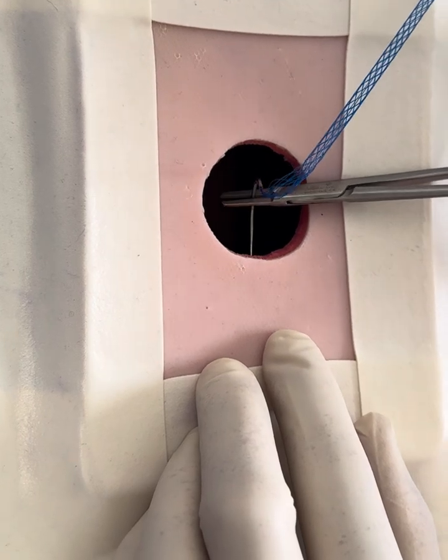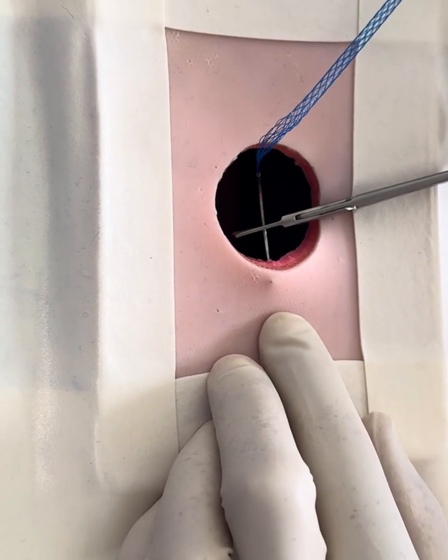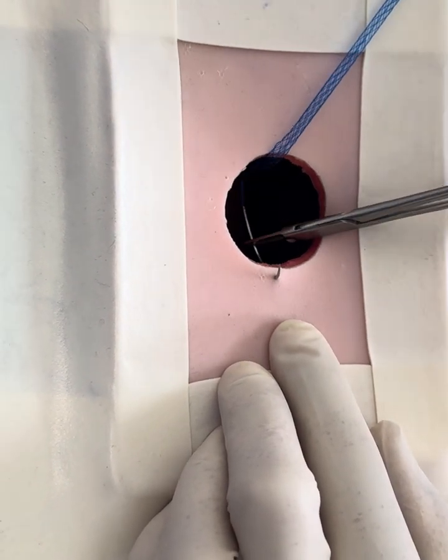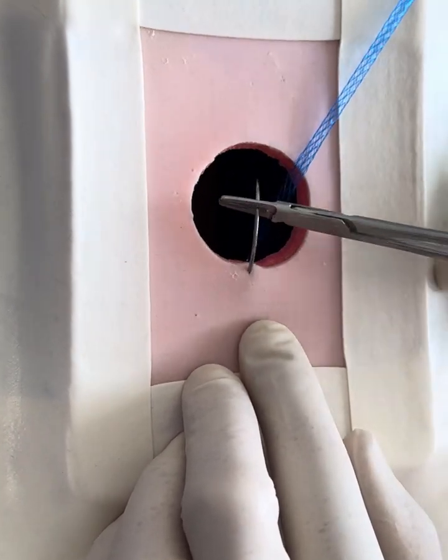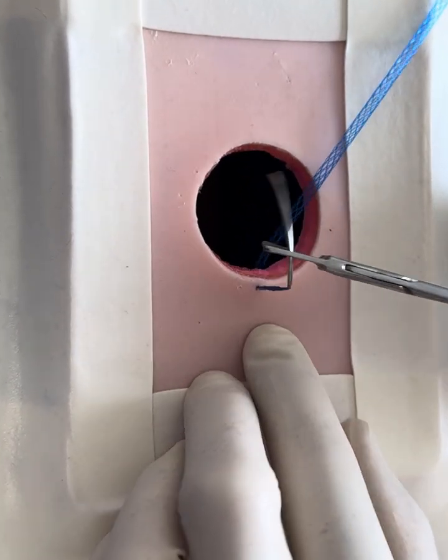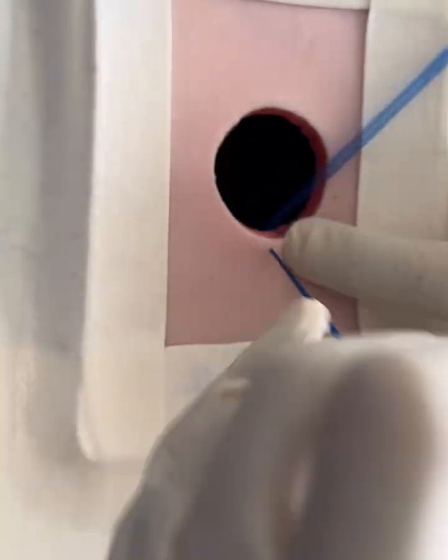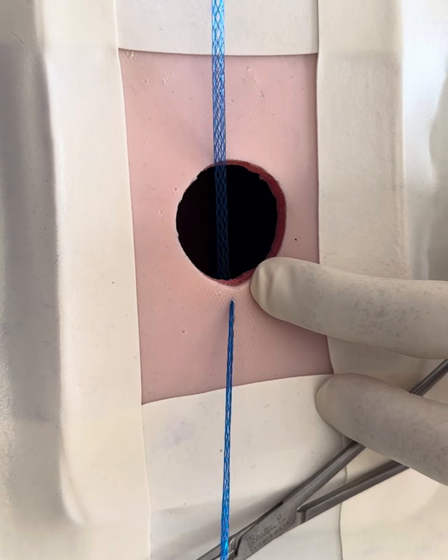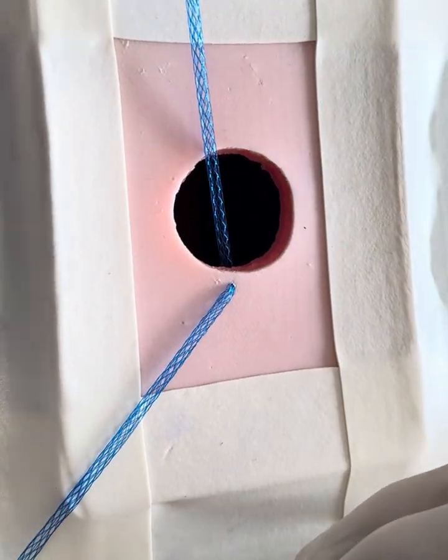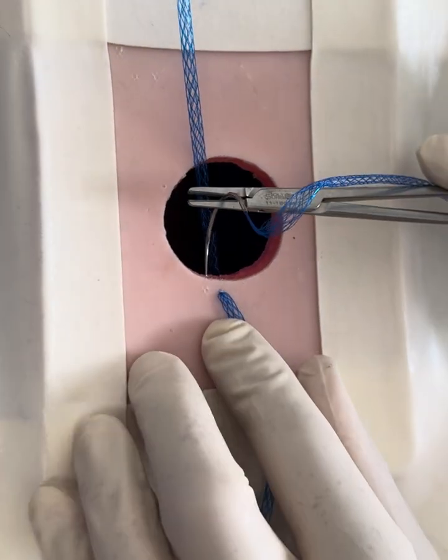Okay, so you pick your start point and then we hope the needle holders are strong enough. And then we put in initially a figure of 8 stitch to anchor the whole process.